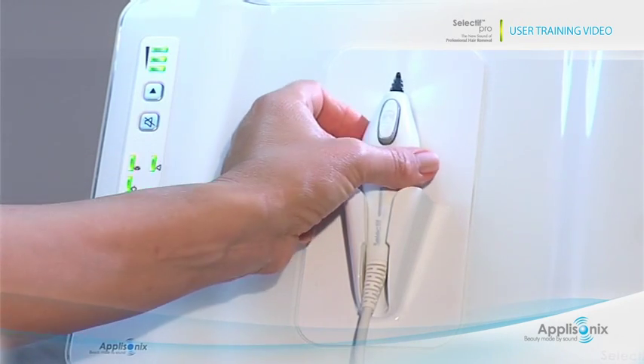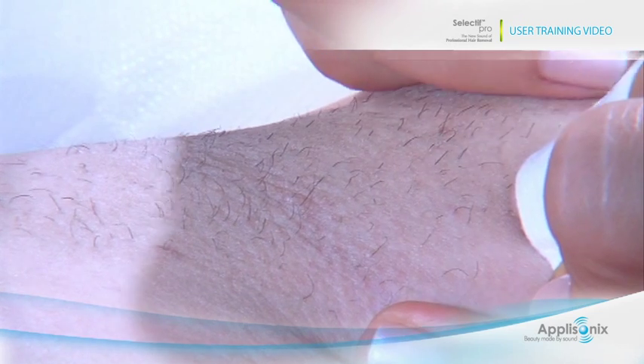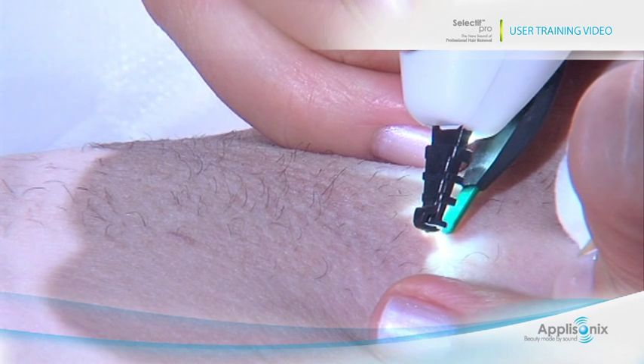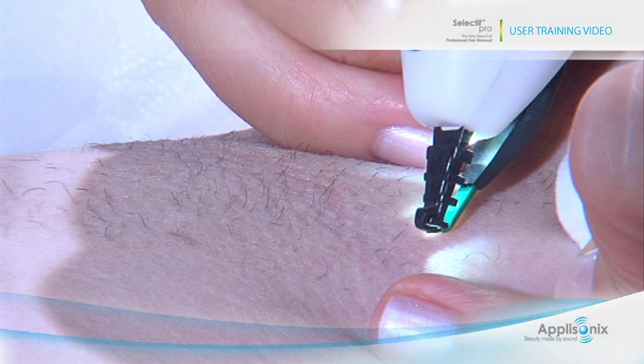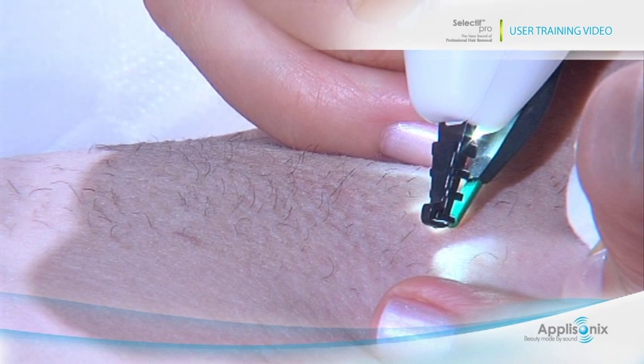Take out the probe from its holder and start the 1-2-3 operation for each hair. Step 1: press the open button to open the tip. Grip the hair you wish to treat as close to the skin as possible, but without actually touching the skin. Release the open button — the tips will close and hold the target hair. Step 2: trigger an ultrasonic pulse by pressing the ultrasonic pulse initiation button or foot pedal. During the ultrasonic pulse, a buzzer sounds and the illumination light flashes.